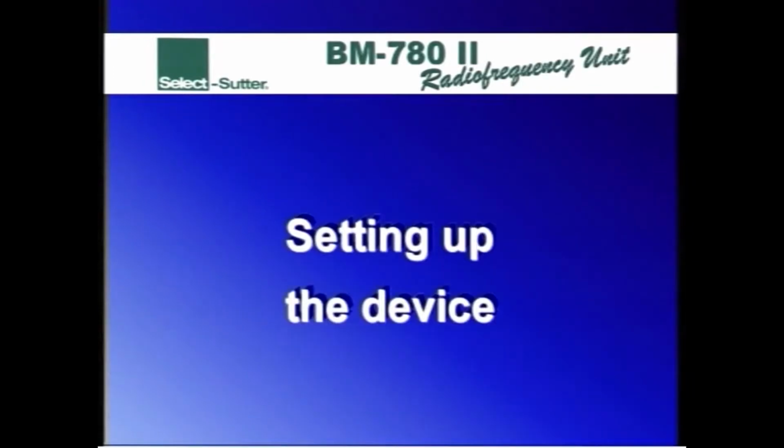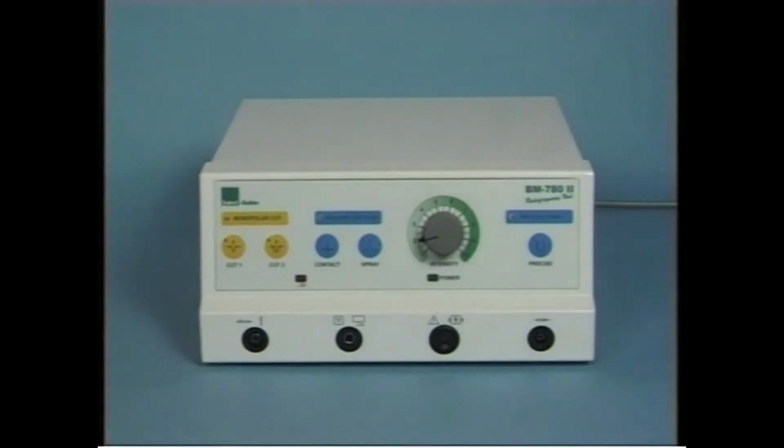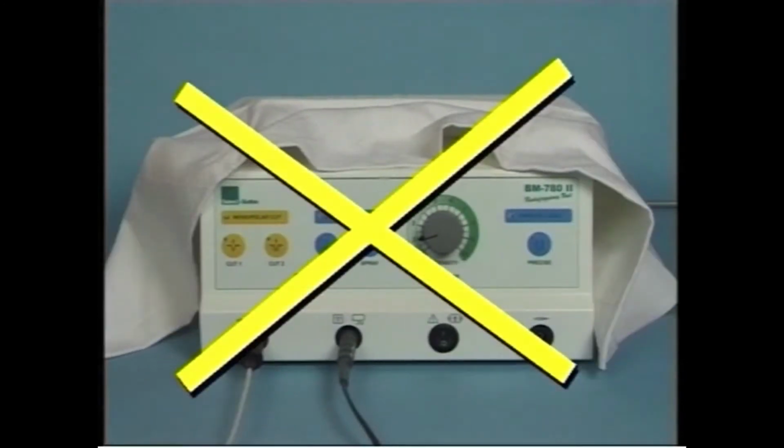Setting up the device. The generator must be set up in a stable position on a flat surface in a clean and dry environment. The machine should never be covered in any way during use, because that could lead to overheating or to the muffling of acoustic signals.